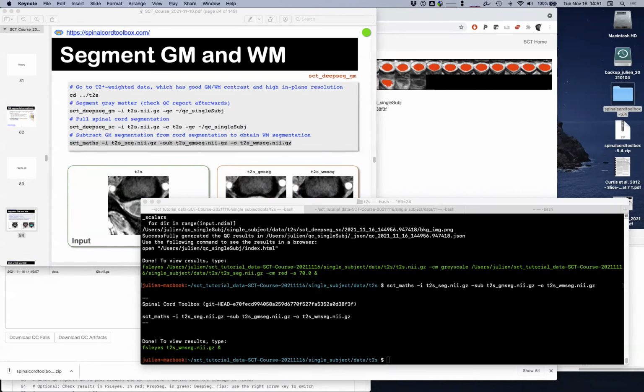Right. So I didn't really go into the details of the segmentation algorithms, but it's using some normalization of the batch.